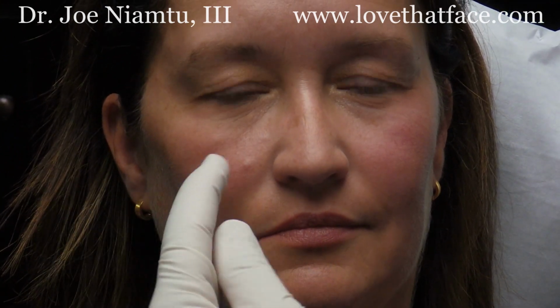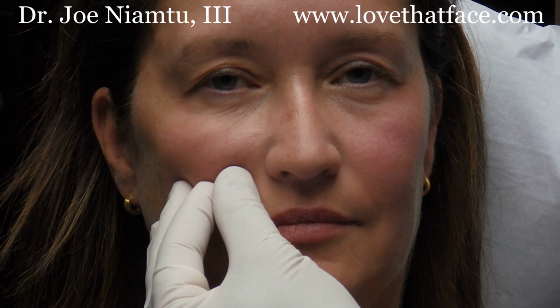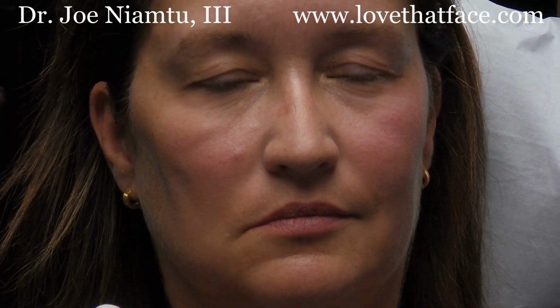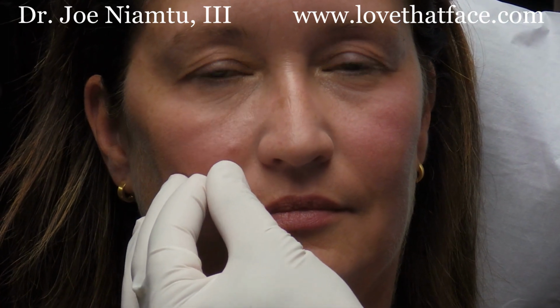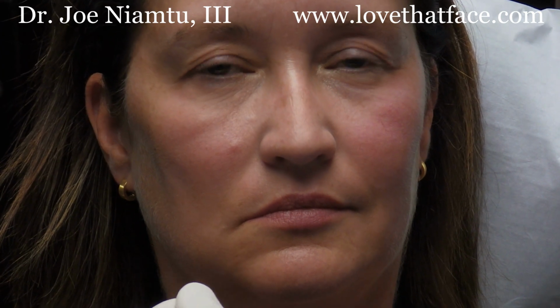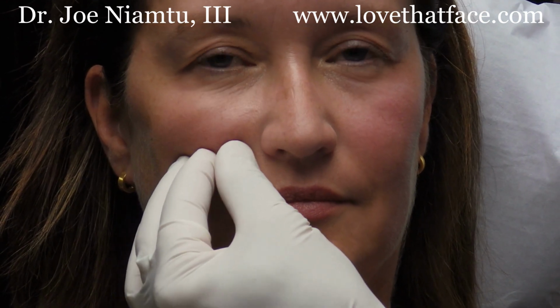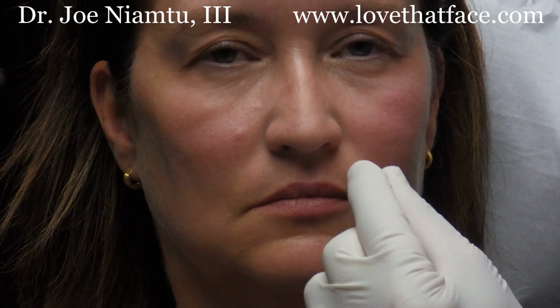And basically, you can see she has a little notch right here. And if you go like this, it pops it out. This is very important. So from there to there is youth. I want to show you again. We have a trough there. When I push on it, it pops that out. We're not talking about a lot of volume here. We're talking about just even sometimes drops of filler going from there to there to there. I know I'm beating that into the ground, but there to there is rejuvenation.